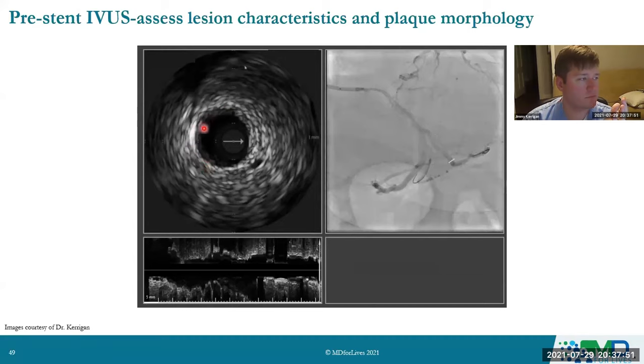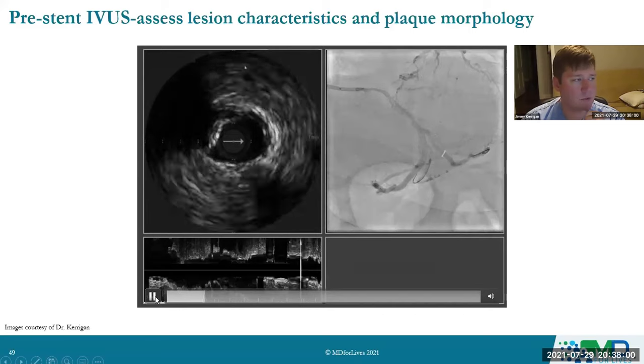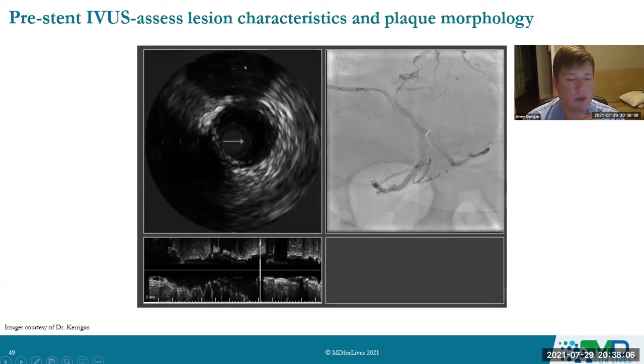The lumen is here. So our plaque burden is probably less than 50%. We'll let the computer decide in just a moment. So then we continue our pullback. This is a manual pullback with a 20 megahertz catheter. And I find a spot proximally in the obtuse marginal that has less than 50% plaque burden. So the vessel is here. The lumen is here. And then we'll calculate.